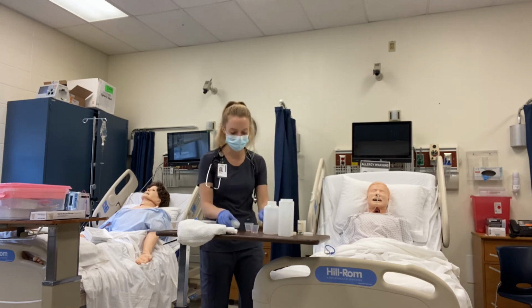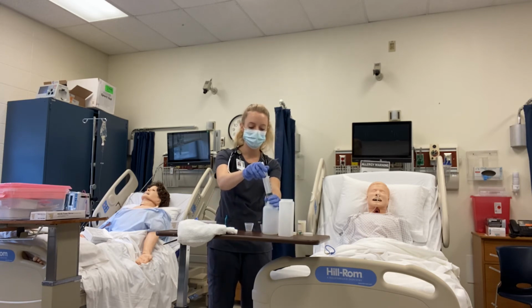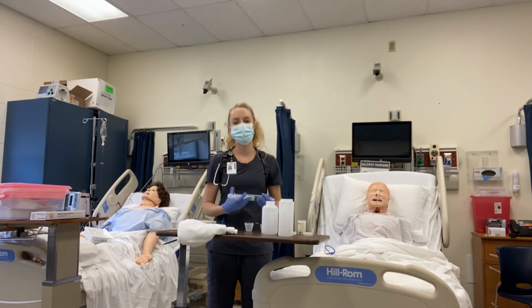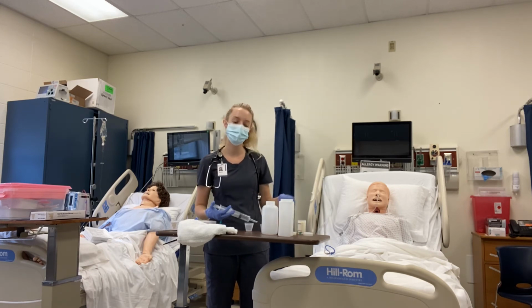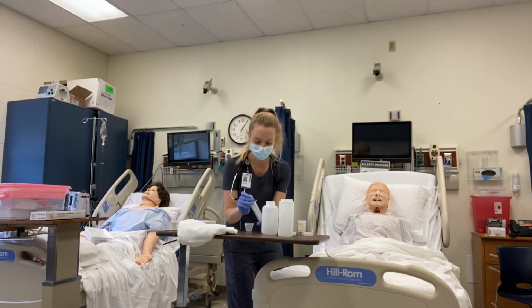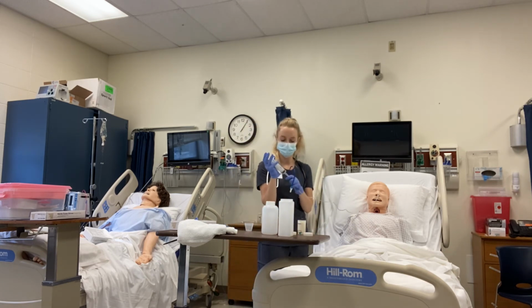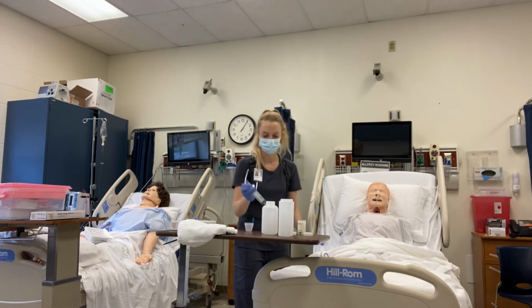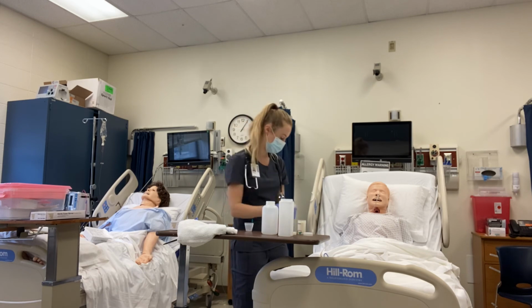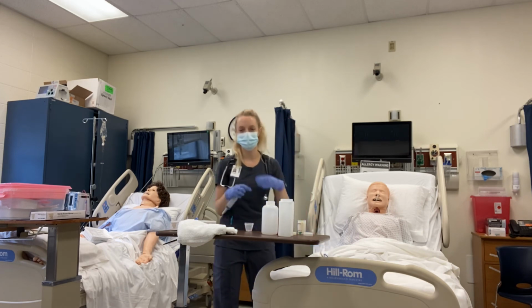I would now like to take my prepared medication. I'm going to draw up 20 to 30 mils. I'm going to make sure that my medication is okay to be crushed and passed this way. And first, I'm going to flush his tube with 20 to 30 mils of water, clamp it, draw up my medication, unclamp, pass the medication, clamp, 20 to 30 more mils of water, flush again, and continue that process for each individual med.